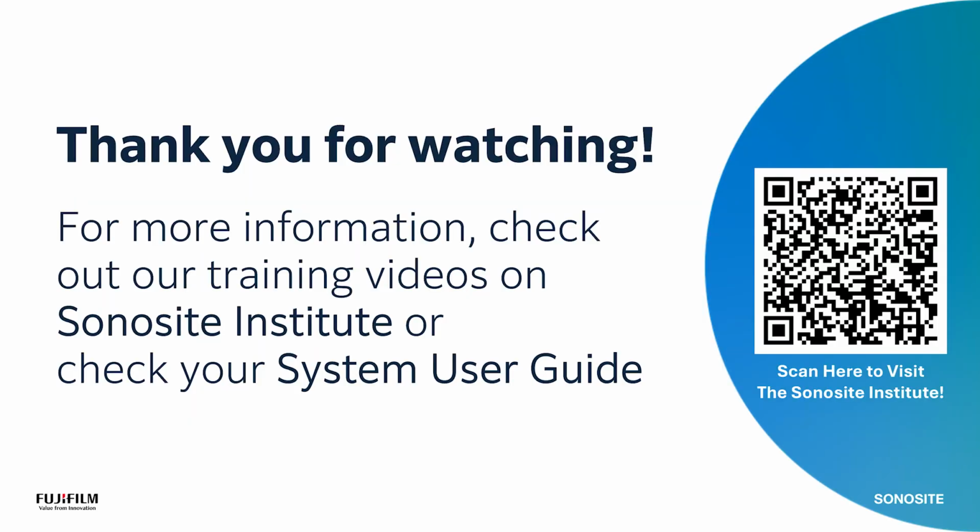Now it's time for you to explore on your own. Watch the how-to videos on the Sonosite Institute or refer to the system user guidelines for more information.